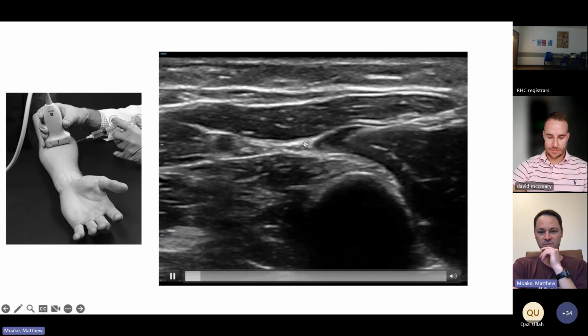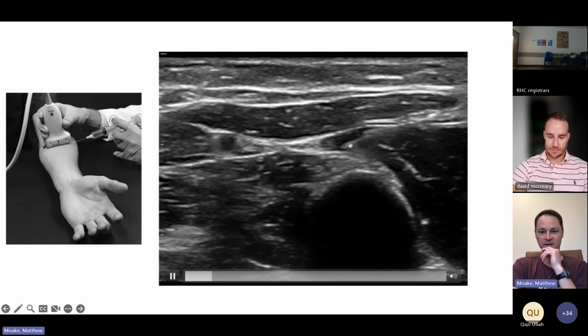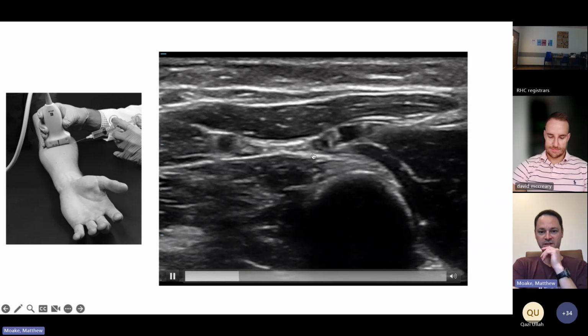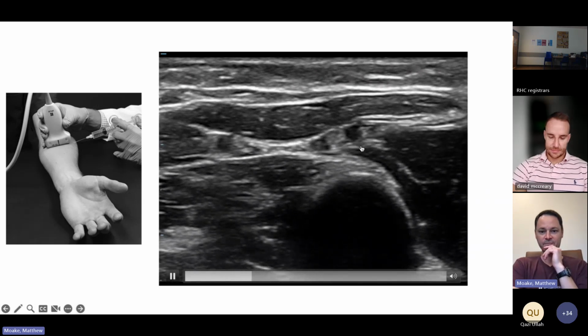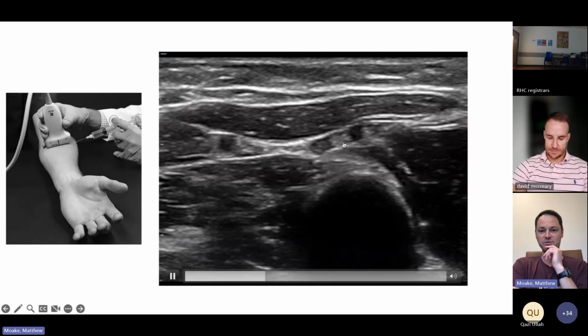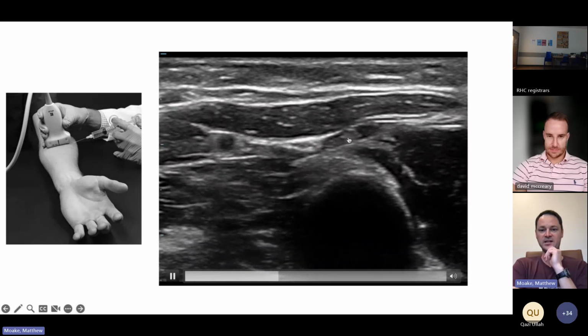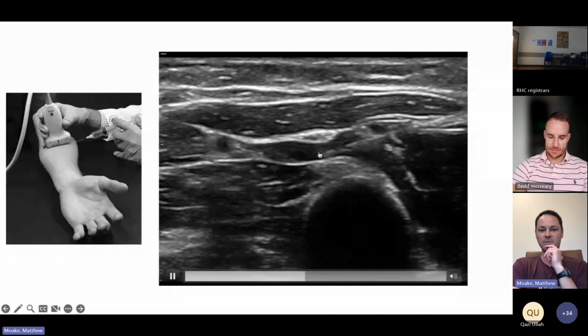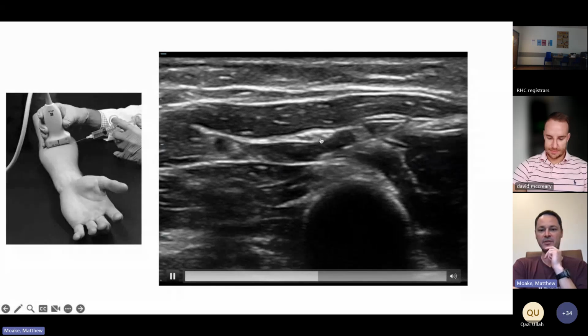Another block here. So radius actually sitting here, needle coming in. And again, artery, nerve, and you can see you've got these tissue planes on the muscle. And so on initial injection, you get this pillowy appearance of the anesthetic being in the muscle plane past the nerve, and as you walk back through it, you can see that anesthetic now starting to dump around the nerve.